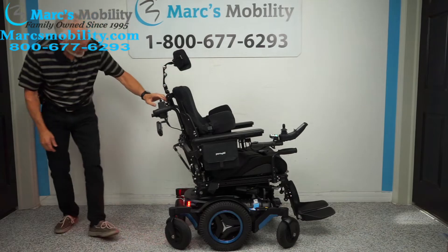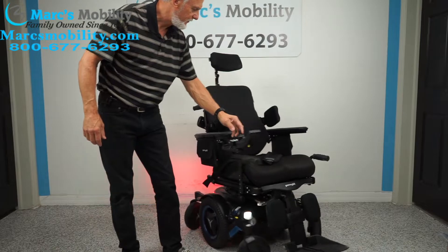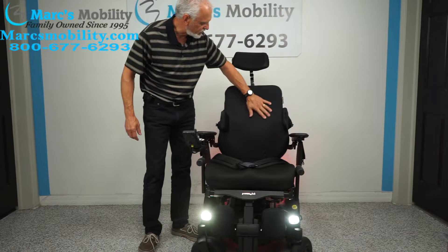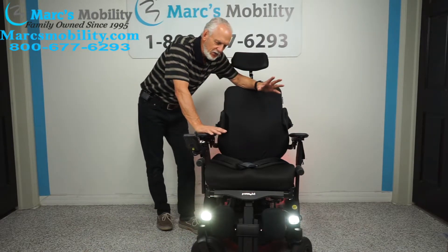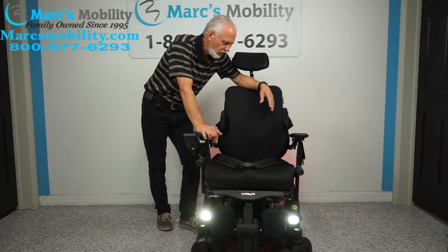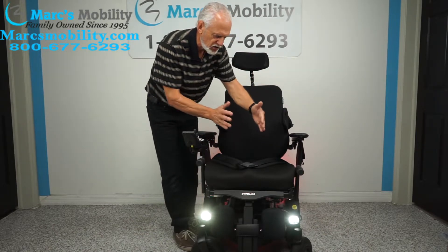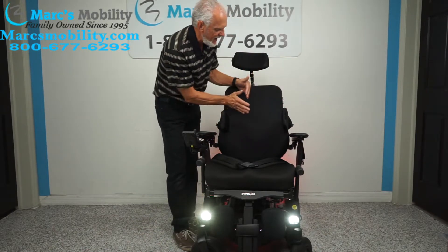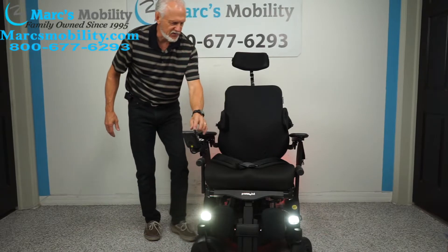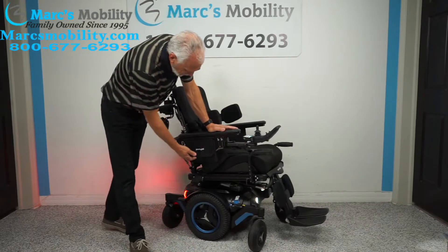I'll switch the control back to the front joystick. The back cushion is a breathable cushion — you're not going to sweat on it. This chair has 13 miles, practically brand new, used maybe a month. If you're 150 pounds instead of 280, we can put in a smaller cushion, bring the frame in, change the back cushion — these seats are adjustable. Just let us know your height and weight.